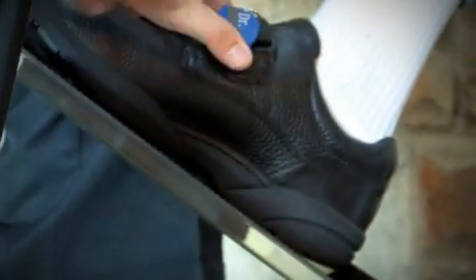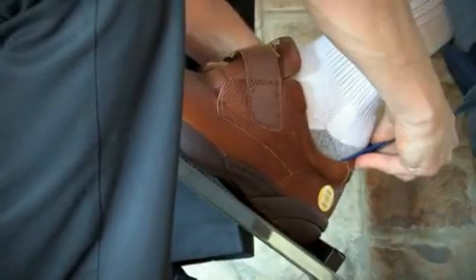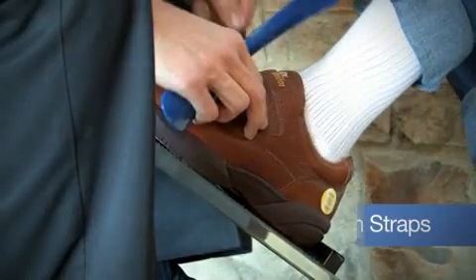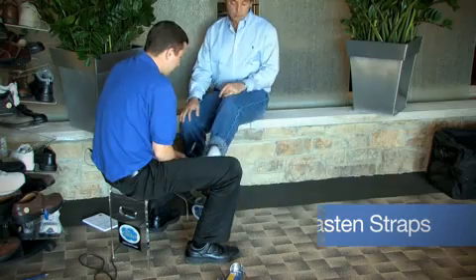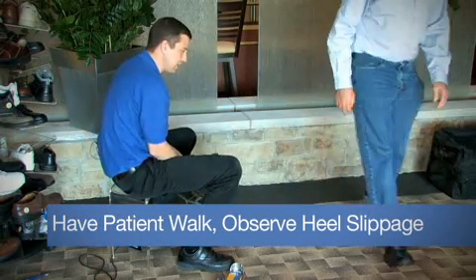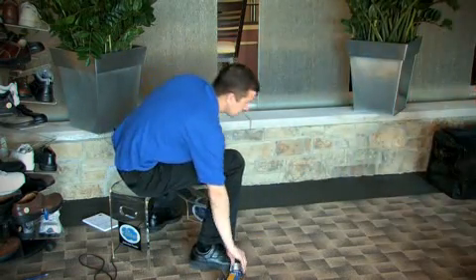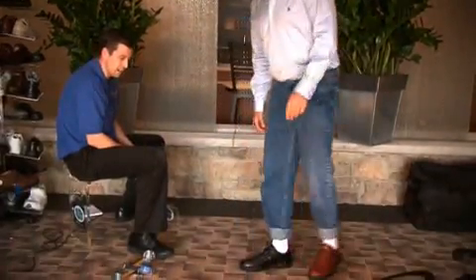This whole time, you should be doing each of these things for the patient. Again, do the same thing for the left foot, having the patient put that on, and again, securely fastening the Velcro strap. Once you've done that, I have the patient walk around. At this point, you'll be observing for any slipping or heel slipping or any issues that you might see. In this particular case, I do see that because this is a 10 wide and not a 10 medium.